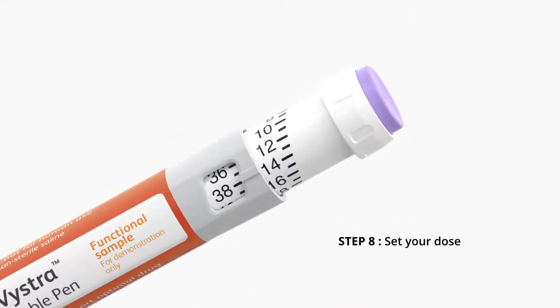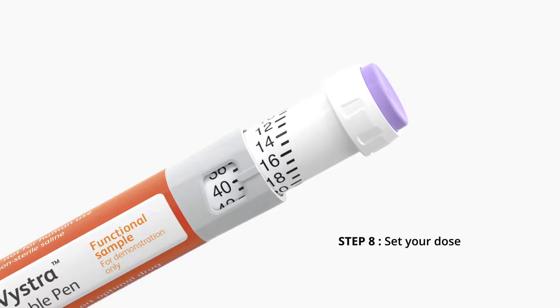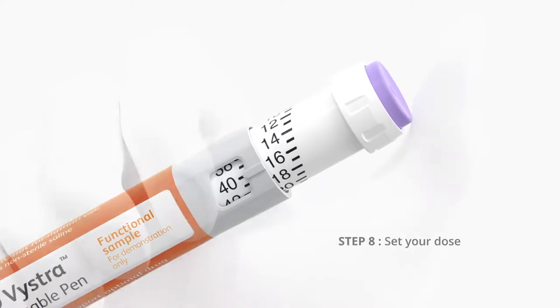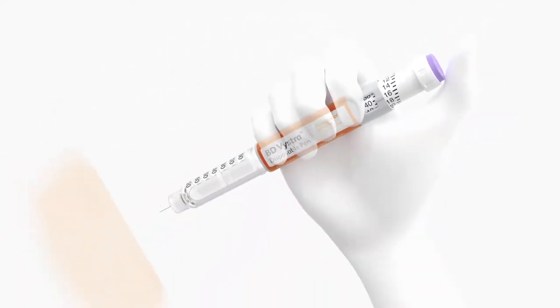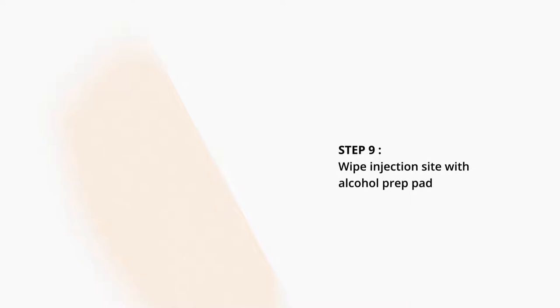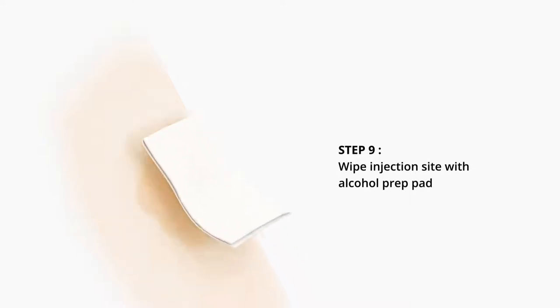Step 8. Set your dose. Step 9. Wipe the injection site with an alcohol prep pad. Allow skin to dry.